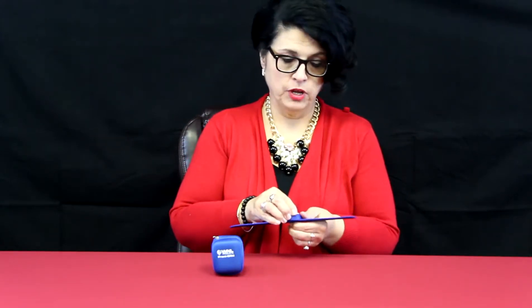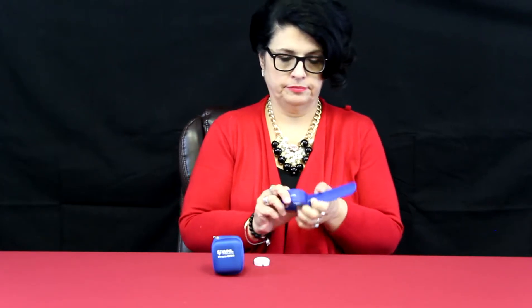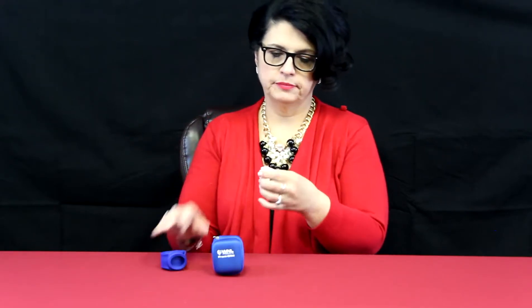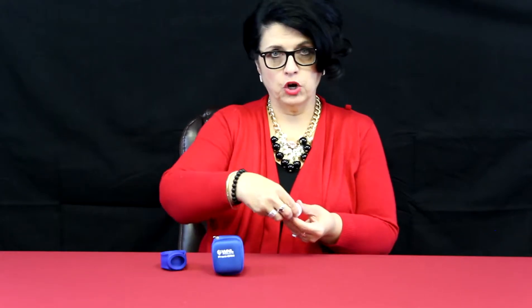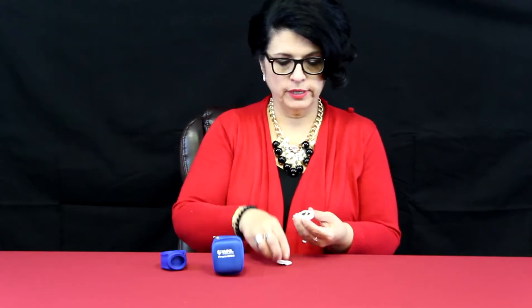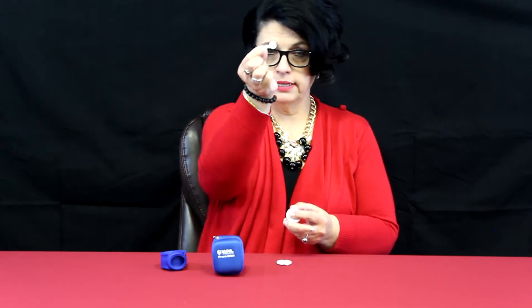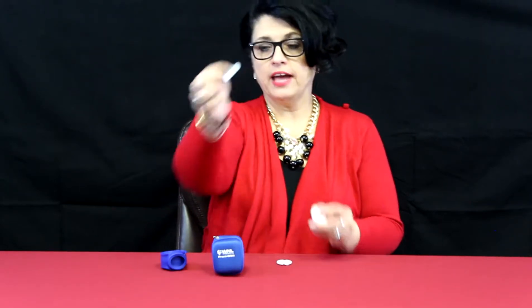Next I want to show you something that I learned the hard way. When you first get your feedback device, your Practi CRM, you need to take out this little white piece — it just pops out of the rubber piece here. You need to open up the back, which takes a little twist, and then you are going to see a white tab, a little tiny white tab that needs to come out.